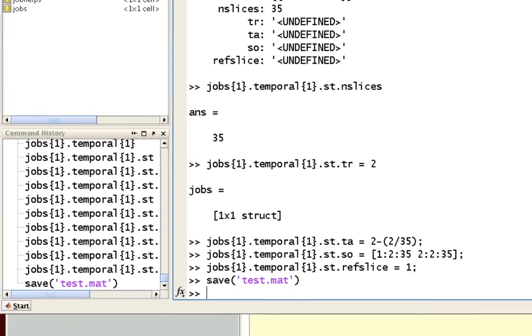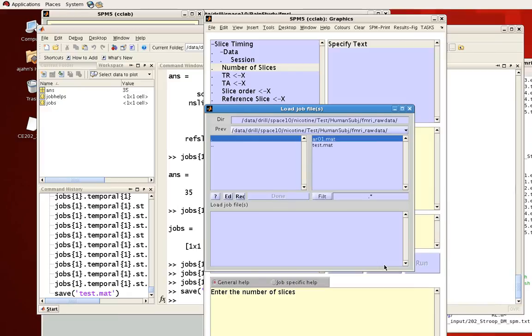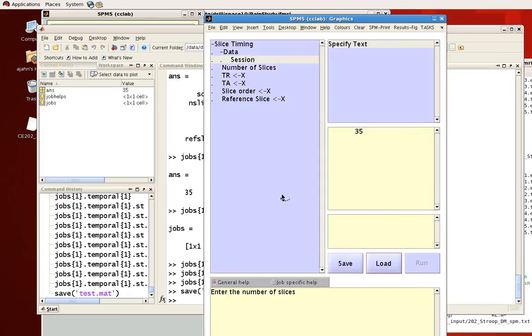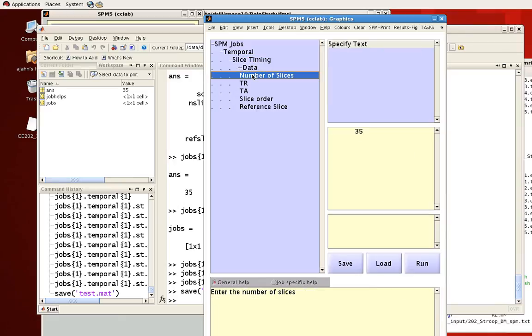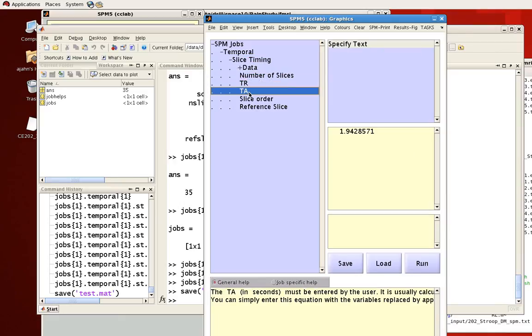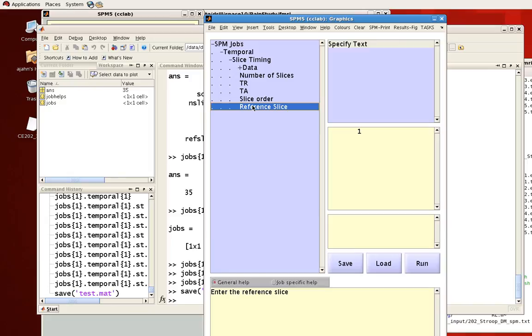And now if you go back to the graphical user interface, you can click here to load that mat file, test.mat. Notice now that all these fields have been filled in with what we put in in the command line. So this is a very simple introduction to this interface between both the GUI and the command line and how you can fill in stuff from the command line and then load it back into the GUI.